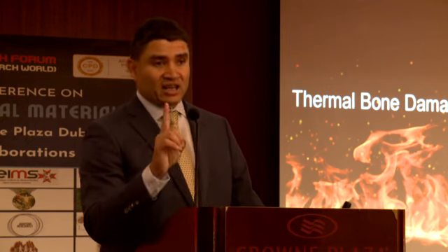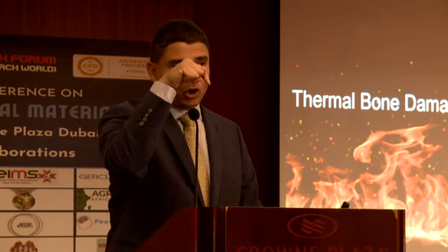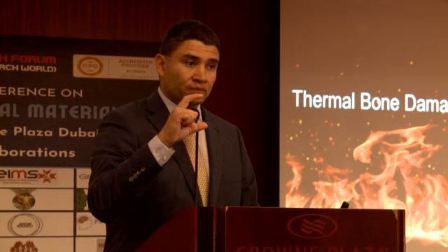Well, let me tell you guys that external irrigation is only efficient and effective to cool your drill the first 2 millimeters of the osteotomy. After that, beyond the next 2 millimeters, that irrigation doesn't cool anything, right? So if it cools down only the first 2 millimeters, what happens with the other 8 millimeters for my 10 millimeter implant I'm going to place? They're not cooled down.